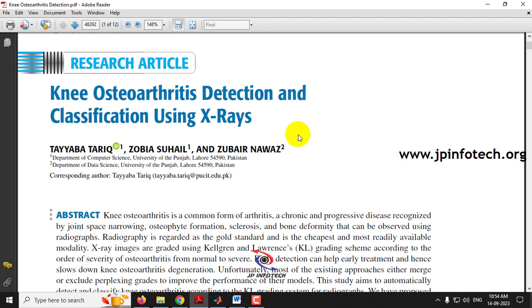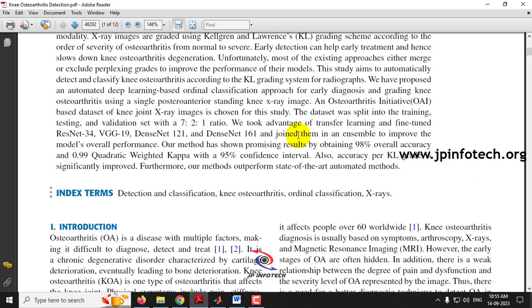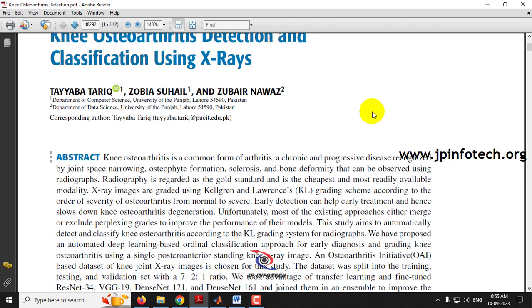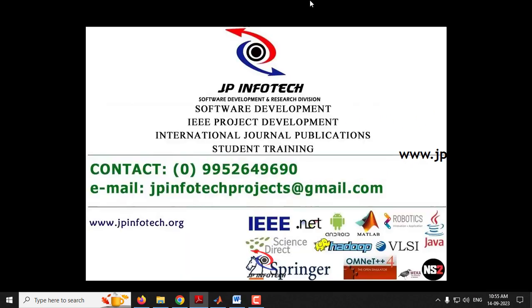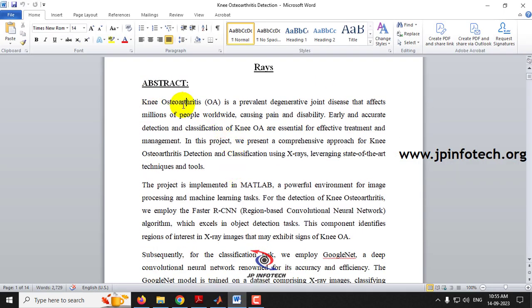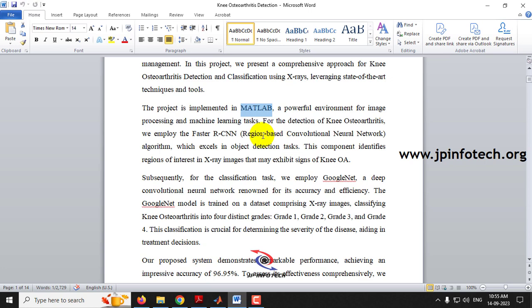In this base paper, the authors developed a Knee Osteoarthritis Detection and Classification based on X-ray images using various deep learning models and image processing techniques. We are not going to use the same approach as mentioned in the base paper. In our proposed system, as described in the abstract, we implemented it using MATLAB and we are going to use two different models.